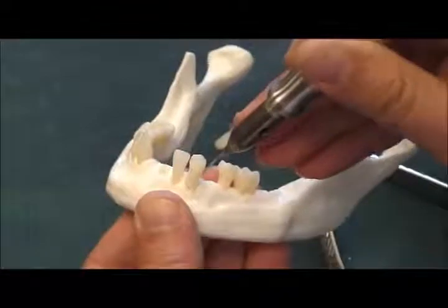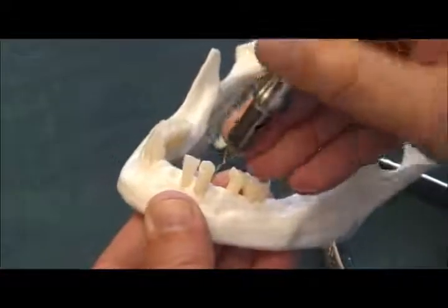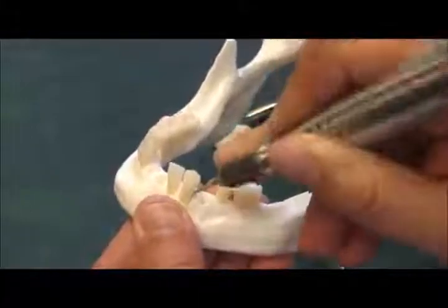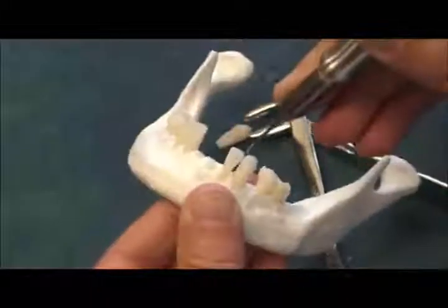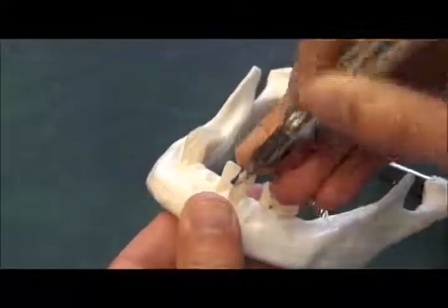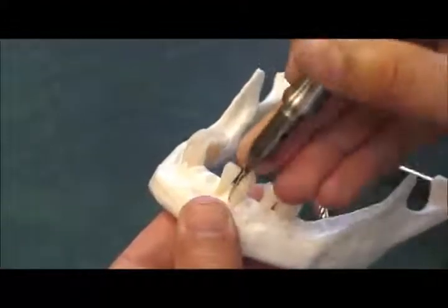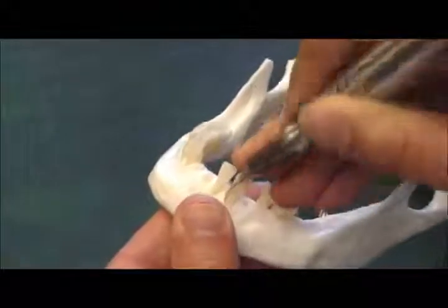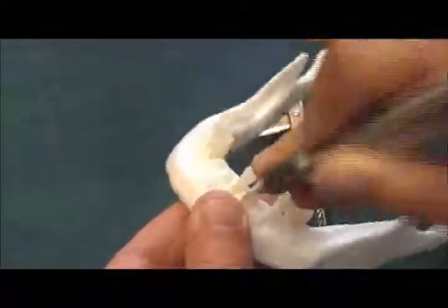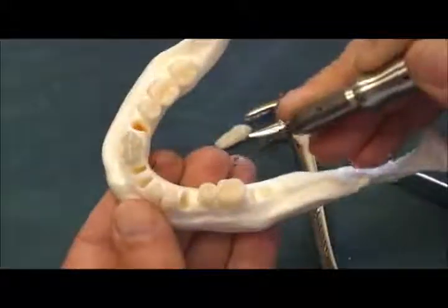You can come more into the interproximal area as well, depending on your access. Generally, I don't do as much work on the lingual, just because the bone's so much denser there. And generally, once you get the three surfaces, the mesial, buccal, and distal surfaces, freed up, the tooth's pretty close to ready to come out.